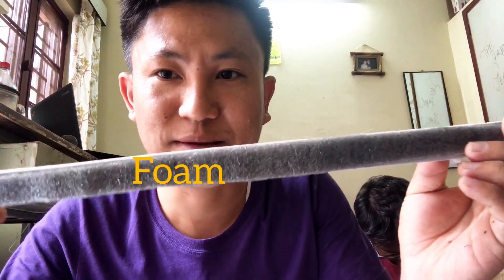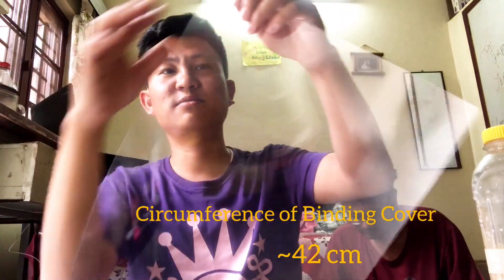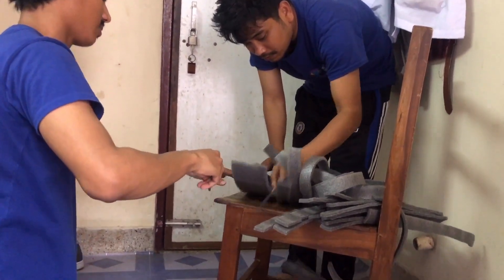We need to make a paper profile. We need to cut the profile inside. Likewise, we can cut this profile.